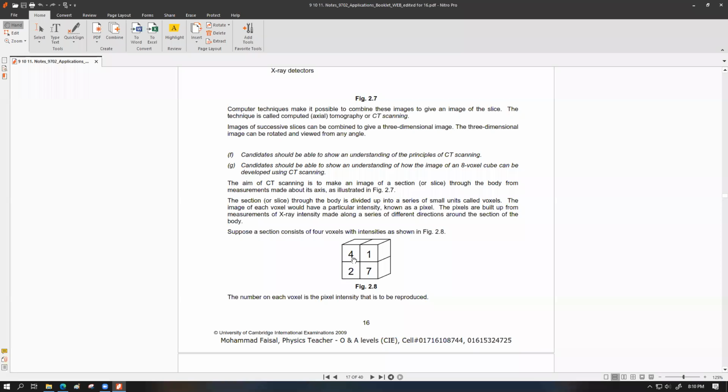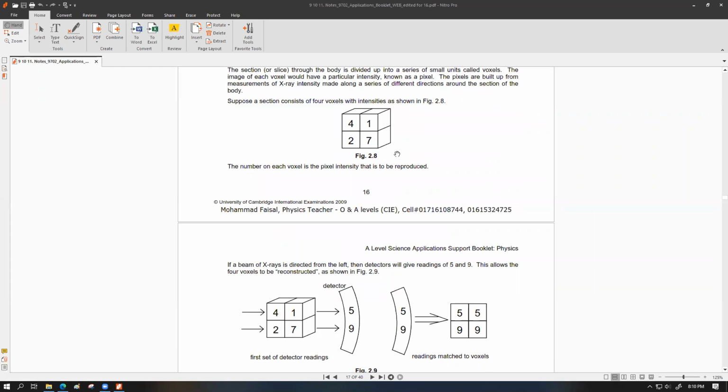And we're going to get to these numbers by calculation, where these numbers will not be readily available as shown over here. Now, voxel equals volumetric pixel. Yeah, exactly. So a 3-dimensional pixel. Thank you, obviously. So how does it happen?